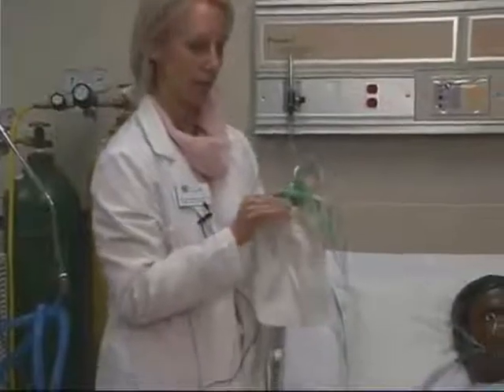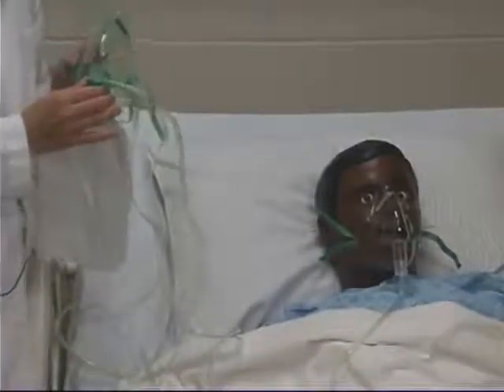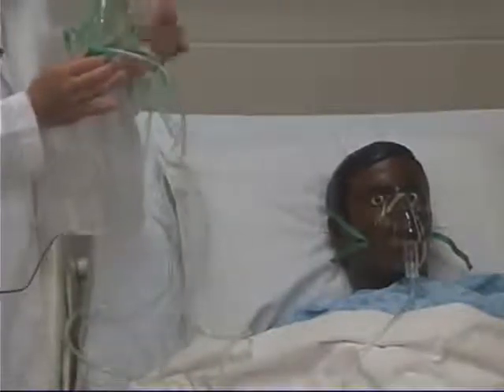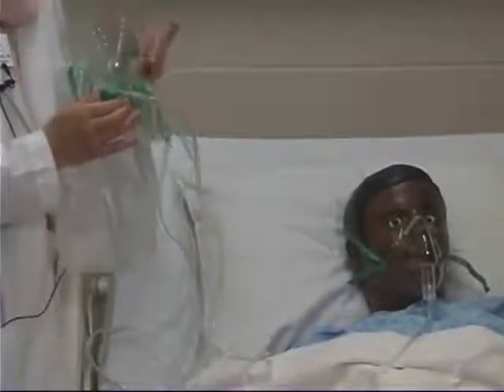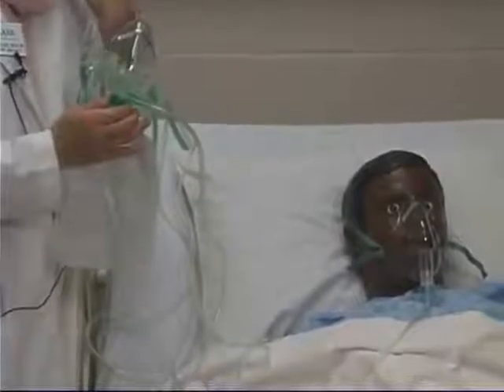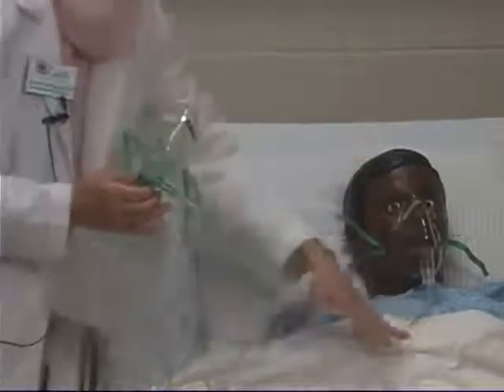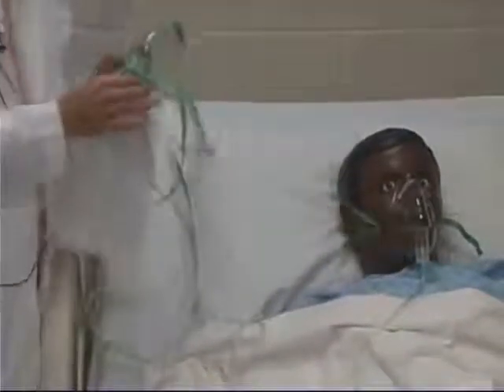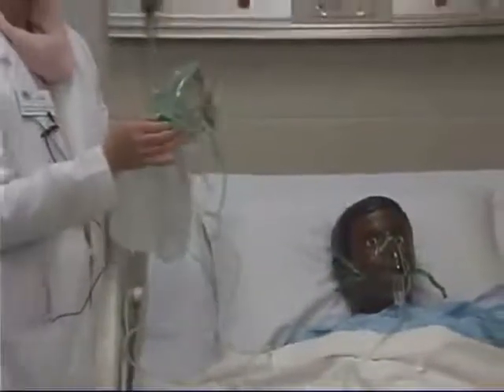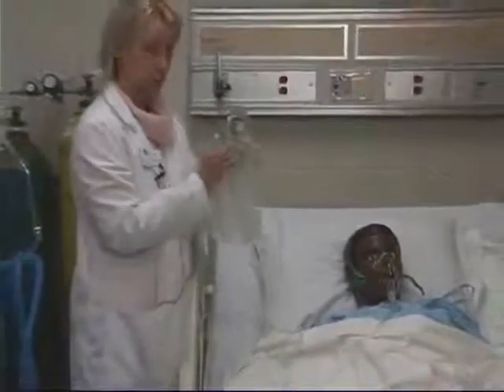As for how much oxygen can be delivered compared to the simple face mask: with the simple face mask set between 8 and 12 liters per minute, that delivers between 35% and 65% oxygen. If you drop the flow below 8 — and especially below 6 liters per minute on the simple face mask — there is a very high risk of the patient re-breathing carbon dioxide that was exhaled, because there's not enough flow to push out the excess carbon dioxide that may accumulate inside the mask. So if needed, the patient could have an order for the partial rebreather mask.